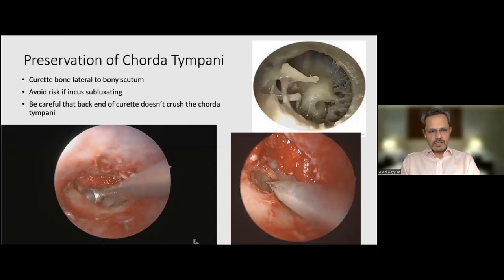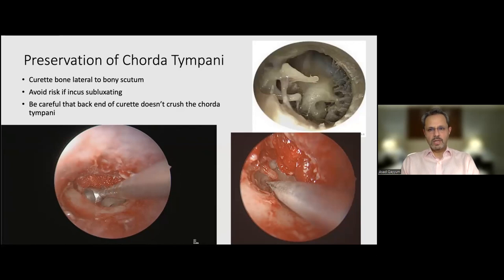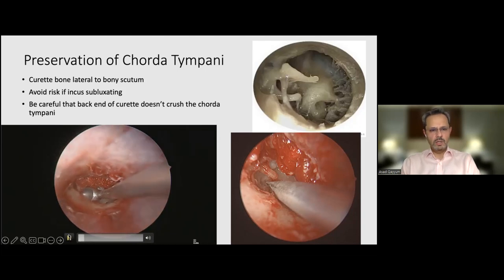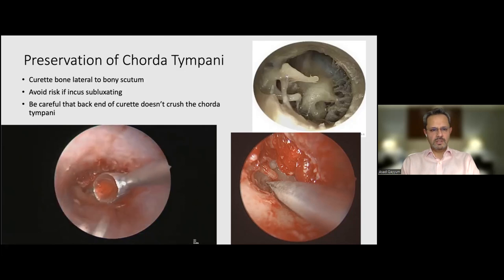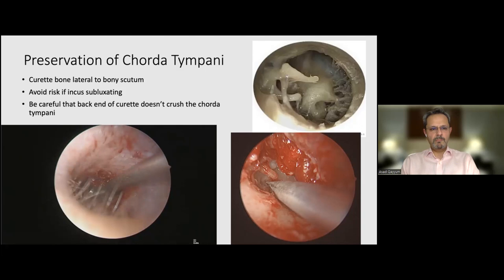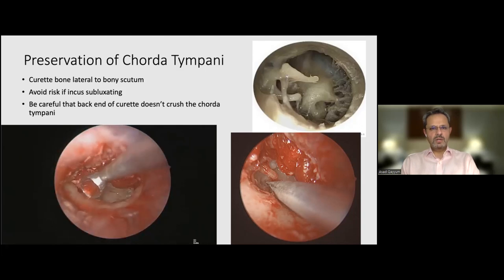I would then curette the posterior wall of the auditory canal to gain access to the footplate. This is not done on every occasion — only if needed, because the endoscope provides the extra benefit of proceeding without curettage. Remember that the chorda tympani travels from the facial nerve in the posterior wall of the auditory canal, under the pars flaccida, and goes behind the neck of the malleus. When curating the posterior canal wall, be careful at the top not to subluxate the incus, and posteriorly ensure the belly of the curette does not crush the chorda.